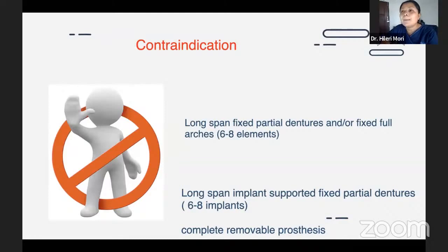And also for the complete removable prosthesis, like your complete dentures, it is very difficult. With an intraoral scanner, what retention, stability and support you get, the complete denture is dependent on this. So with an intraoral scanner you cannot do that. You cannot achieve the right amount of posterior palatal seal with your intraoral scanners, and that's where intraoral scanners are lagging behind, just in that particular arena of complete dentures.